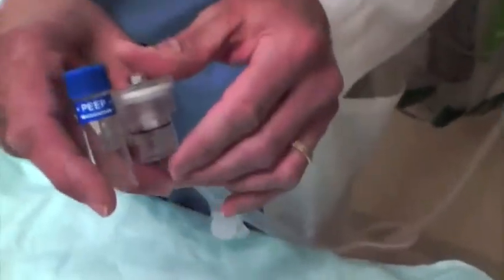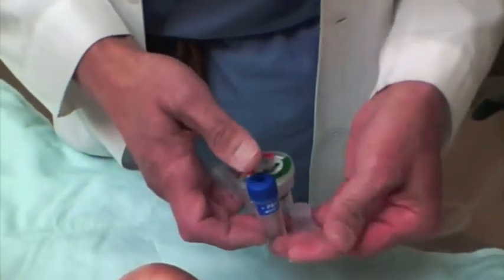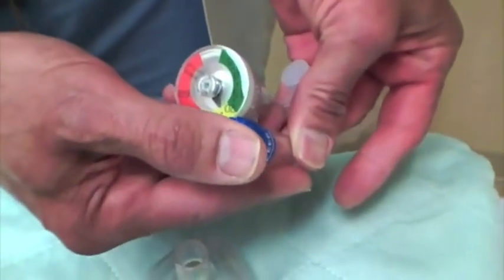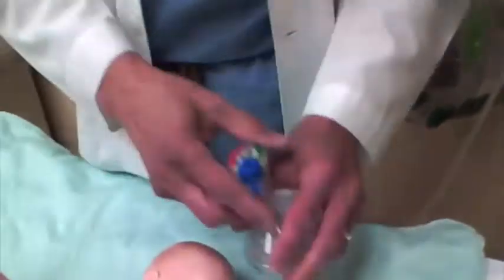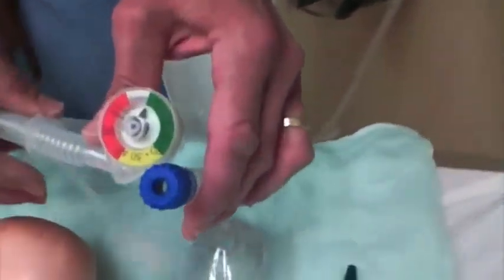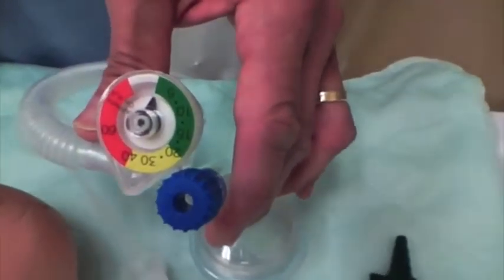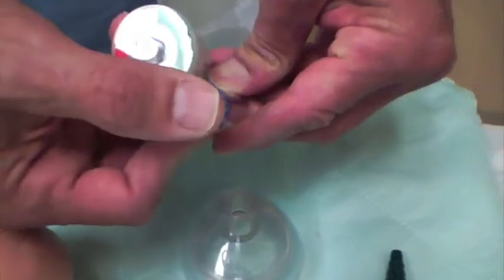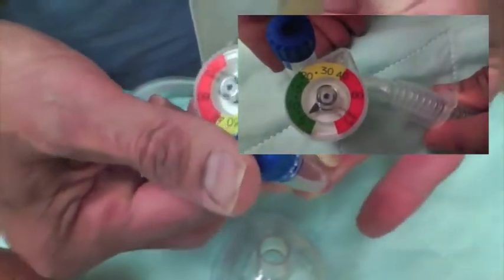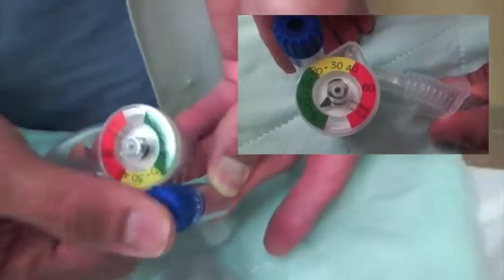Once I intubate the child, I can take the bag valve mask off. This fits over the end of the ET tube, and I can do the same ventilation with that as well. So I can ventilate through a mask or through the ET tube. If the ET tube is on there, I have a seal. The nice thing about this is if you are the nurse or someone helping with the resuscitation, you don't have to worry about how much you're squeezing the bag. All you need to do is close the valve — it'll move and I take my finger off. I don't have to worry about my tidal volume or anything else.